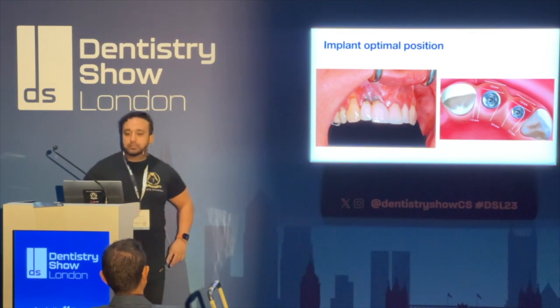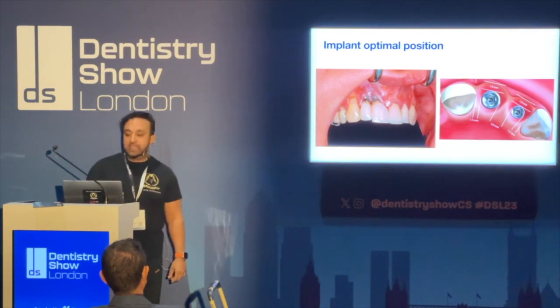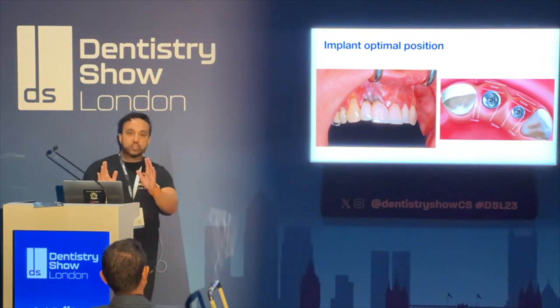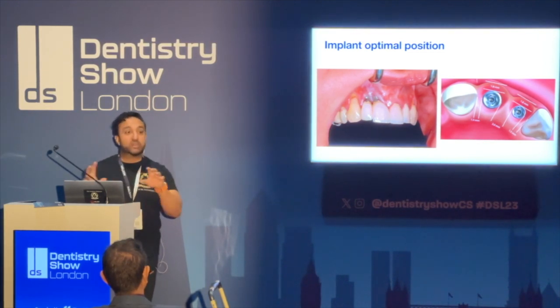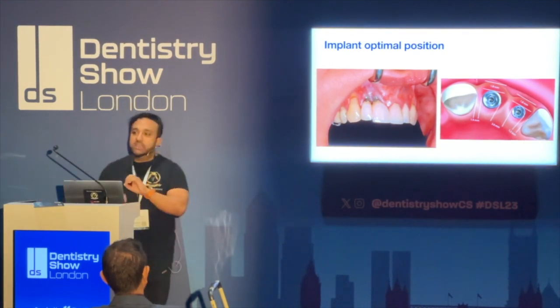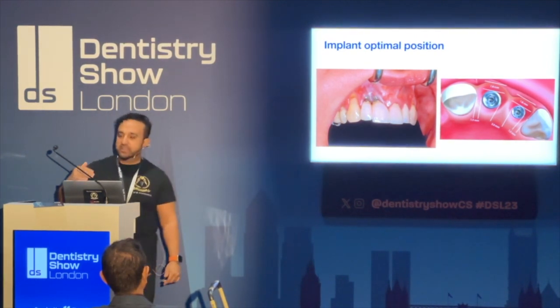So here we are with another case of a complication that you might see, and you might have these two implants. The question being, the general rule of thumb is that you can creep up to a tooth with an implant up to 1.5 millimeters, right? And the space in between two implants should be 3 millimeters, okay? Now, the reason we say that is very simple, it's biological, okay? An implant's ankylosed, it has no blood supply, it's just bone to metal, okay?